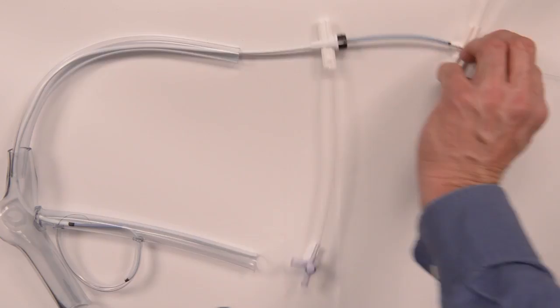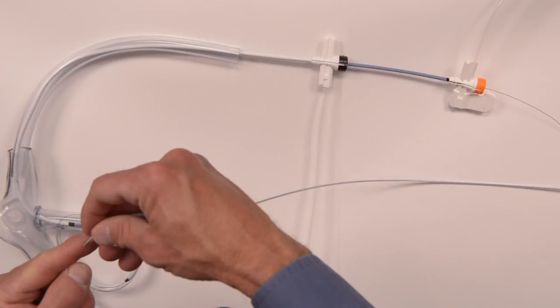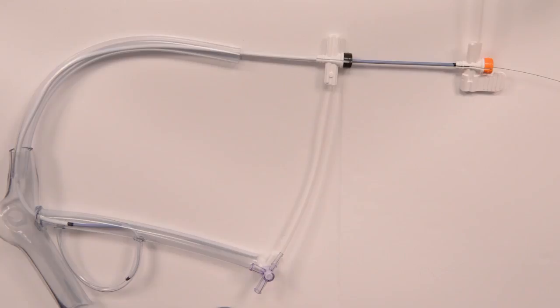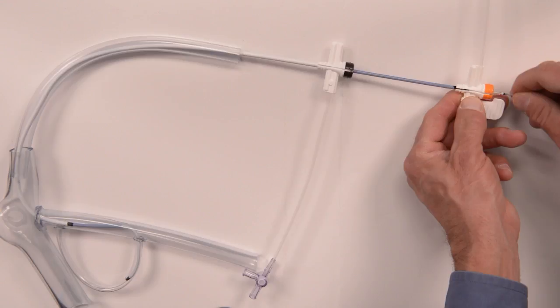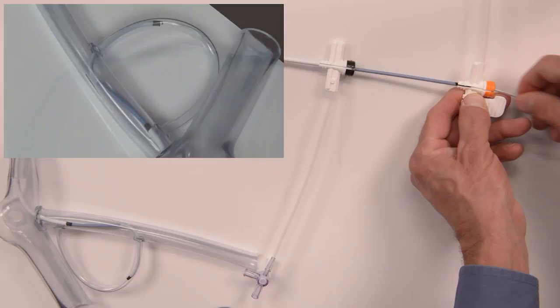At this point I am ready to introduce a pacing lead right over the wire, and it's got so much support with that LVI that it's going to go in easily. I'm advancing the pacing lead now right over the 014 wire. I'll have my assistant grab the end of the wire, hold it there, and then I can just advance this right through the valve. The pacing lead is going to go right through the LVI and right into that vessel. There it goes, and the pacing lead is there.